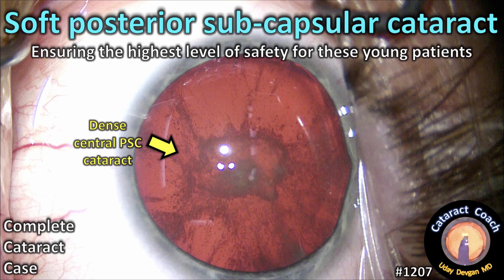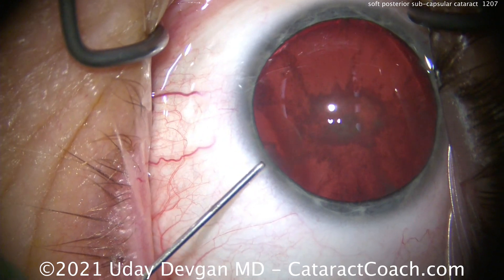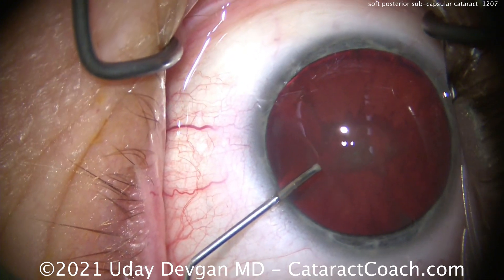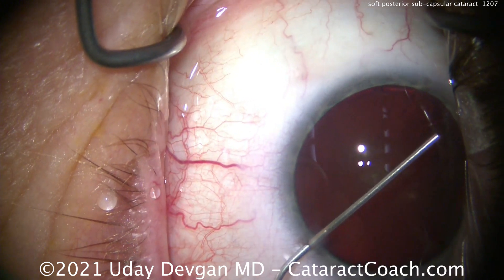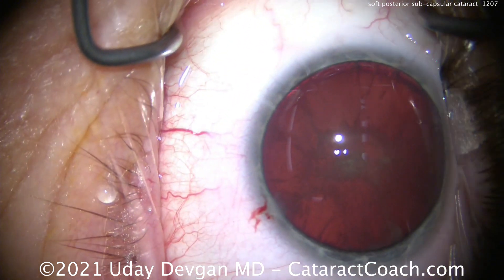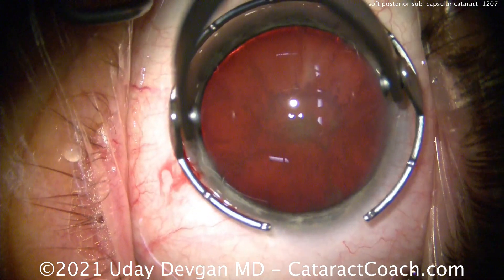From cataractcoach.com: this is a soft posterior subcapsular cataract case. We have to ensure the highest level of safety for this young patient — early 30s — who has a very significant posterior subcapsular cataract due to some systemic issues. This is a start-to-finish case taking about nine to ten minutes, not the typical five-minute cataract. The goal is to give this patient the absolute best outcome, since this surgery needs to last 60 to 70 years.